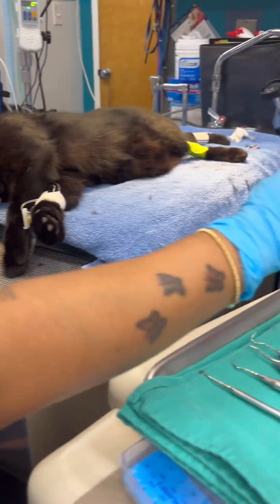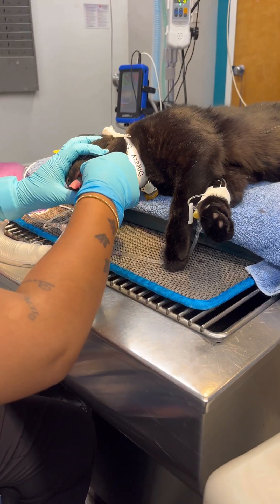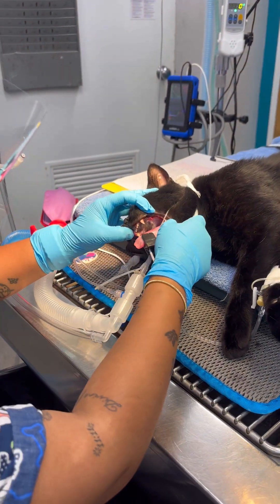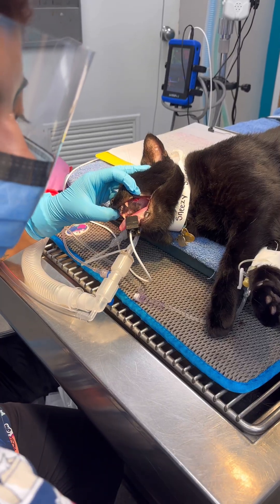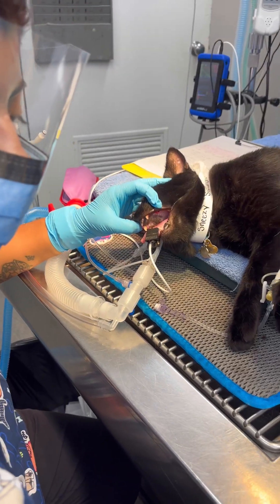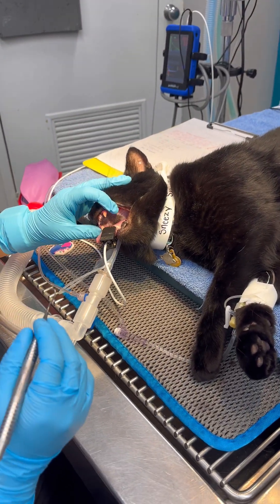And this is the chlorhexidine solution spurring the cat's mouth. I'm just going to start with one side over here. Using the scaler, I'm just going to gently go in and remove any tartar.